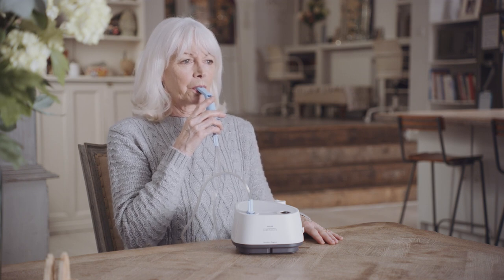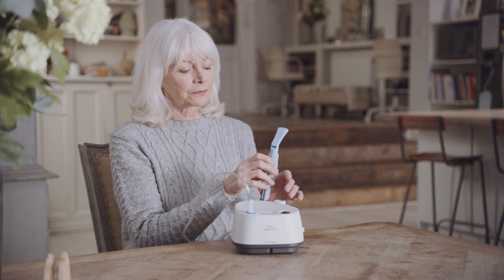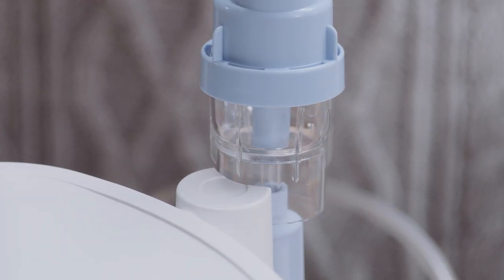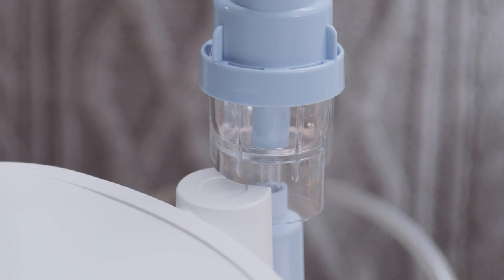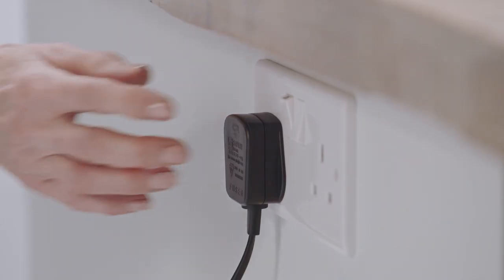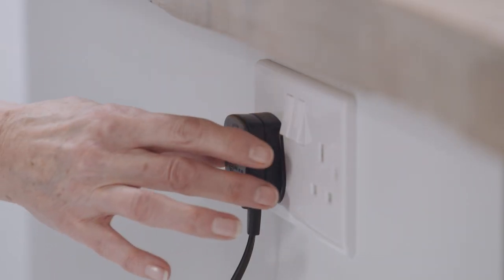When the Sidestream begins to work intermittently and sputters, the treatment is finished. There is no need to nebulise every drop of your medication — there will always be a small amount left in the medicine cup. When your treatment is complete, turn the power switch off and unplug the device from the electrical outlet.